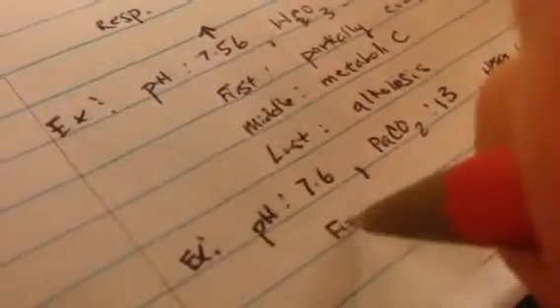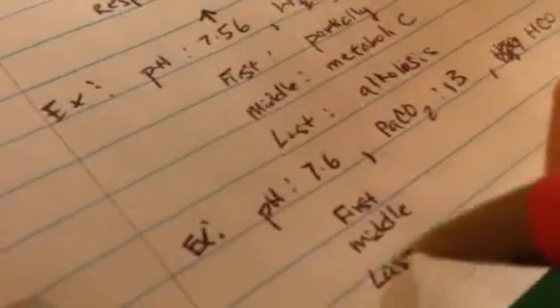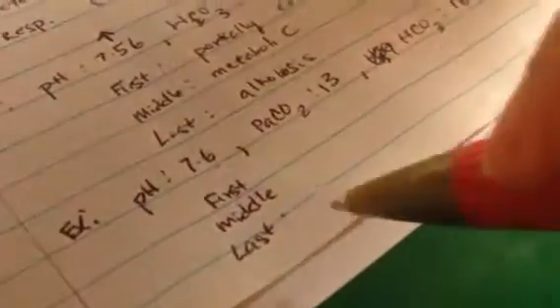Okay? So now what? Well, we still need our first, middle, and last name. Taking a look at the pH, we know that it is increased. So it is alkalosis. Now, these two values are abnormal. So we know that's going to be a partial compensation.